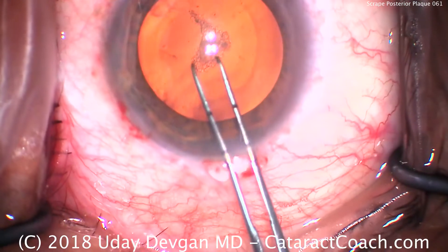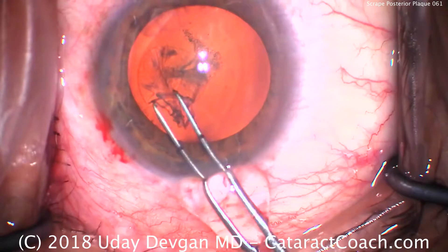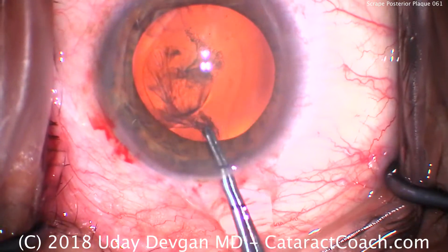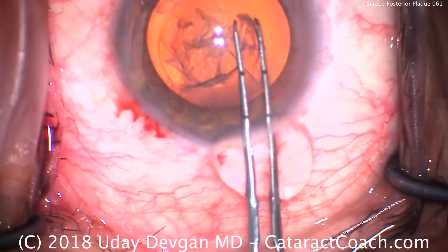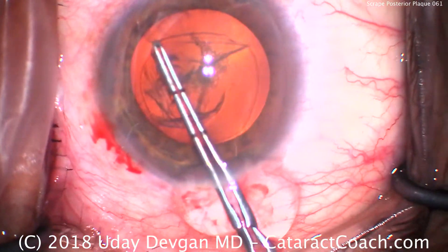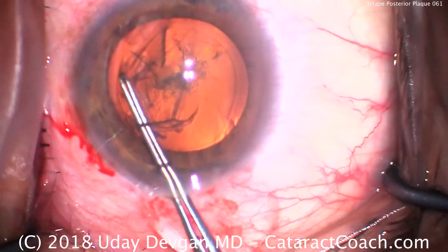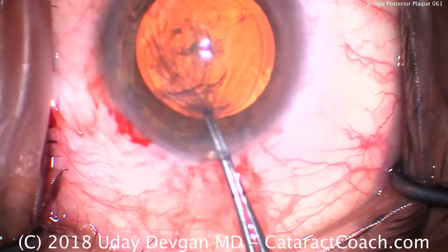For the rhexis, we're going to use our forceps to create a round, circular, about five to five and a half millimeter capsulorhexis. We don't want a baby-sized rhexis — we want just big enough to overlap the optic, which is six millimeters. Somewhere in the five and a half millimeter range is perfect. There's the rhexis being completed.